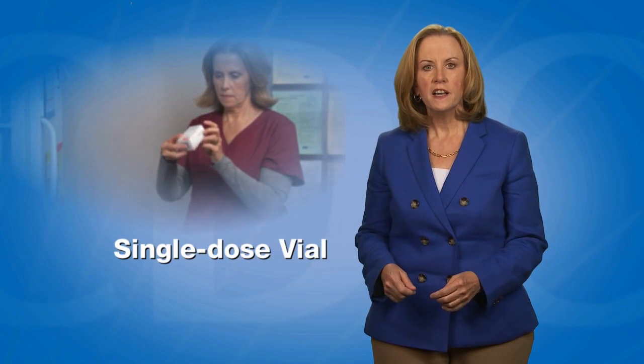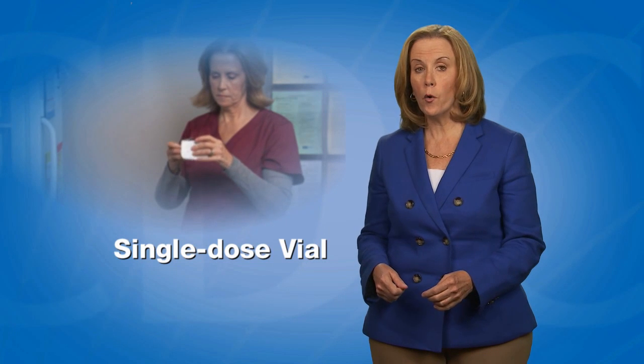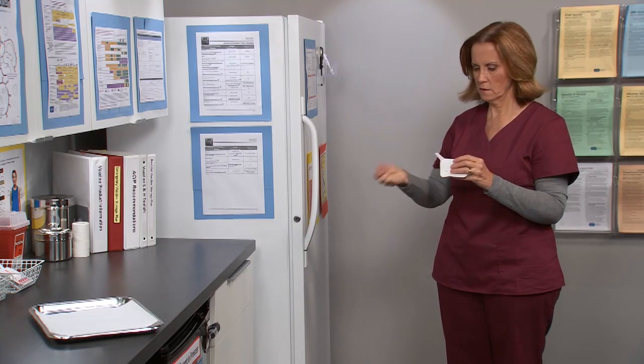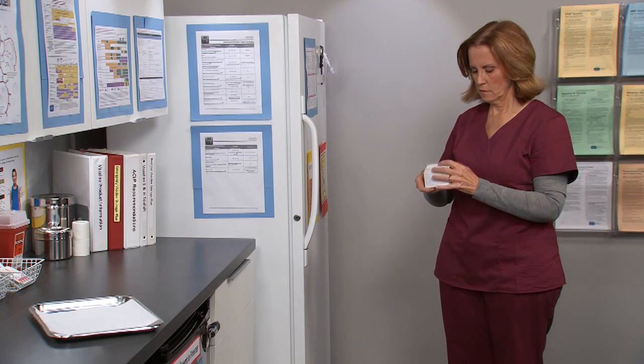In this video, I will describe how to prepare vaccine from a single-dose vial. A single-dose vial of vaccine, or SDV, contains one dose. It should be administered one time to one patient.